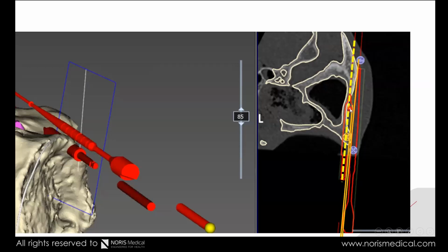In this case, because we already removed this amount of material, what we will need to do is take the tool back and put an entering point here. And then we do it again from this position, and then we'll be somewhere around this angle. So this is a measuring tool that gives us the way to know where we are. And once we understand that, even if we've done something wrong, we can sometimes still correct that.